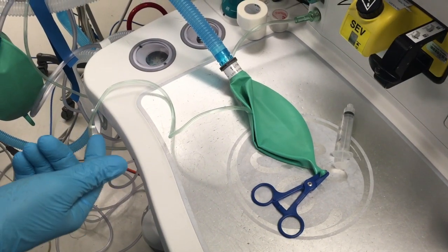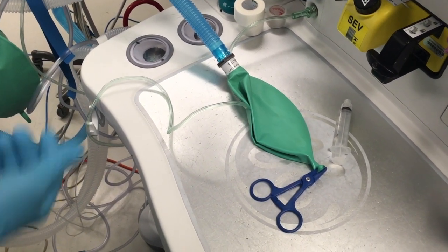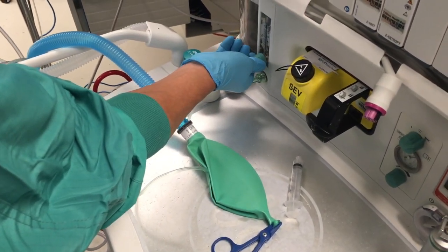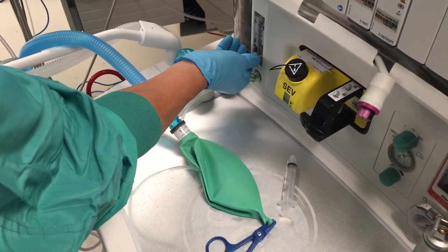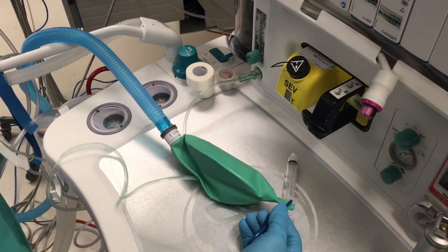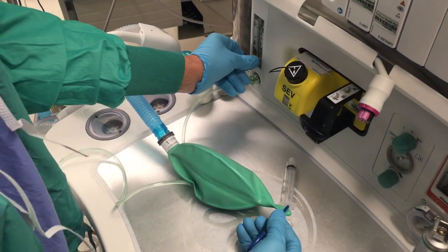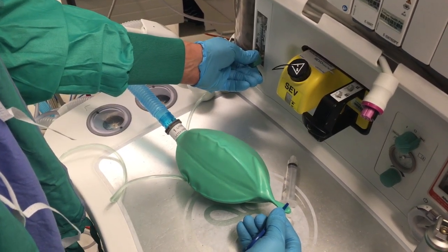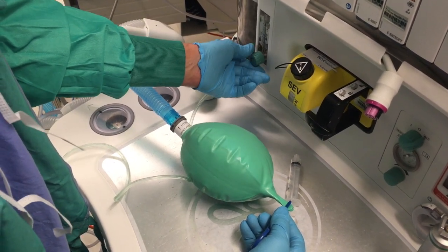In this clip, I'm showing how we can ventilate the patient without switching to manual mode. I simply open the oxygen flow. In this case, I'm going to show you a technique that I would use when the surgeon is asking me to test for leaks. I simply leave the snap on the bag so the circuit's closed, and I slowly adjust the bag till I receive the desired pressure.